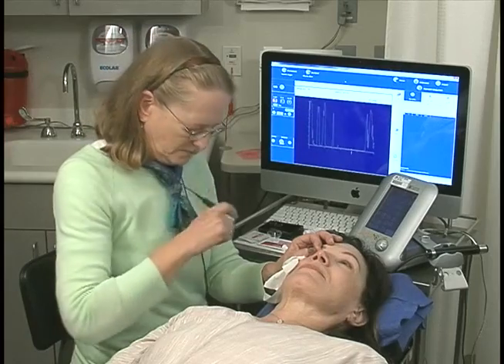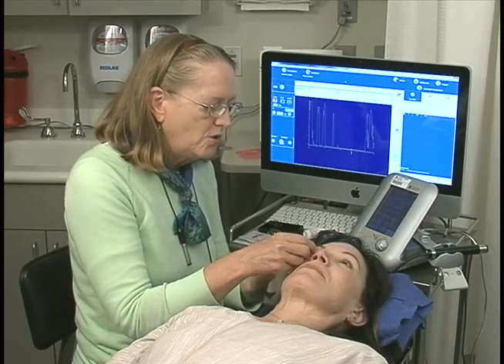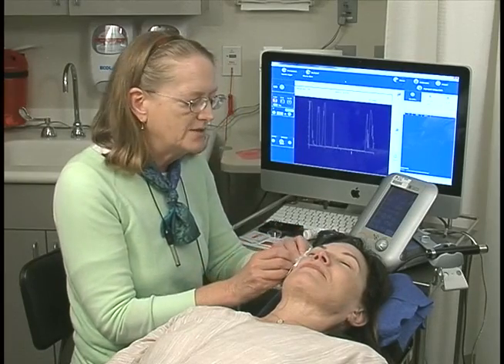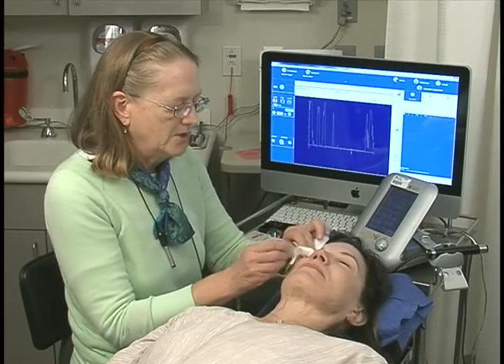To remove the shell, I just hold the tissue at the lateral canthus and pull the lower lid. The patient naturally closes their eyes, squeezes the fluid out, and I catch it in a tissue.